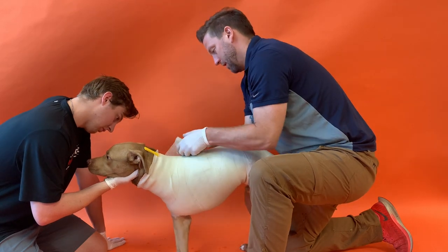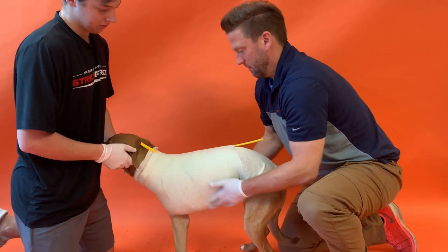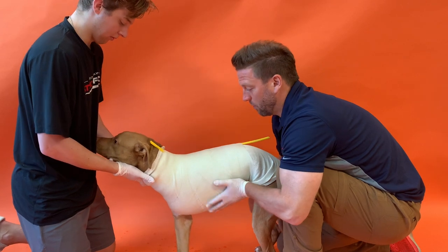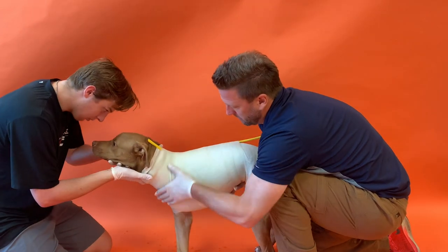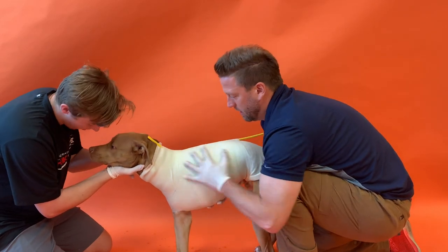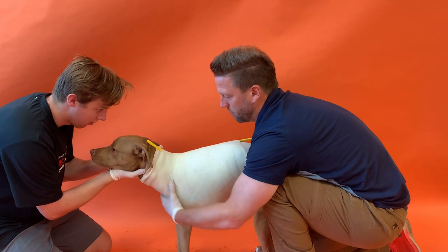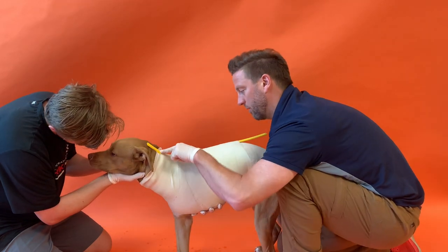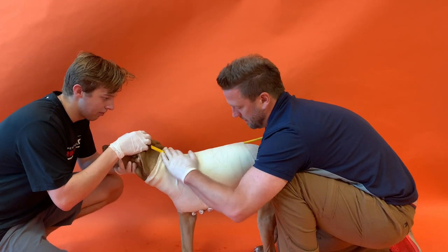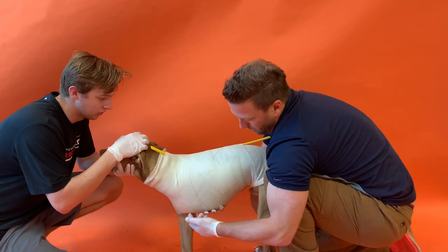Hold the dog nice and straight with his head facing forward, then rub in all the casting material. This takes up to five minutes to set — we have about three more minutes, then we'll cut right down the strip and take it off.